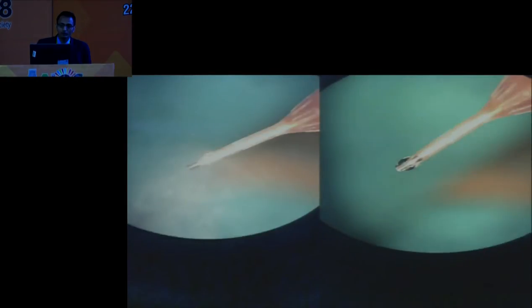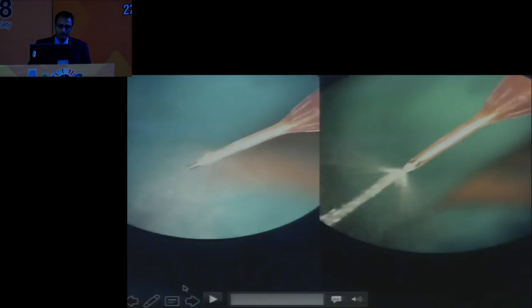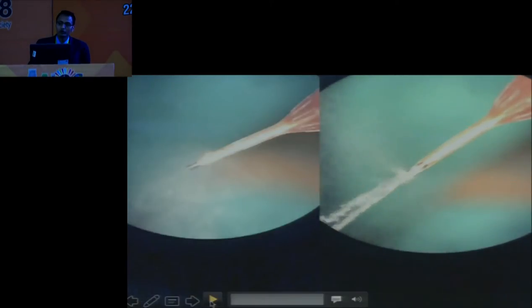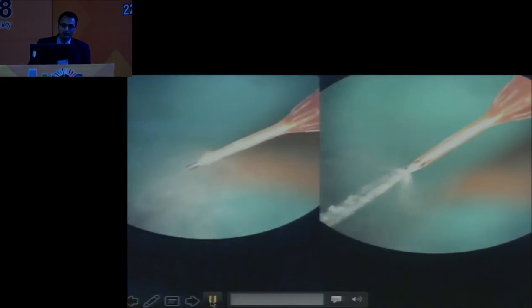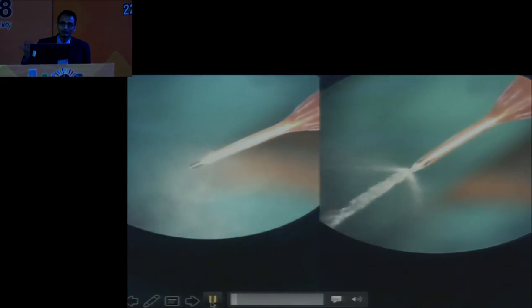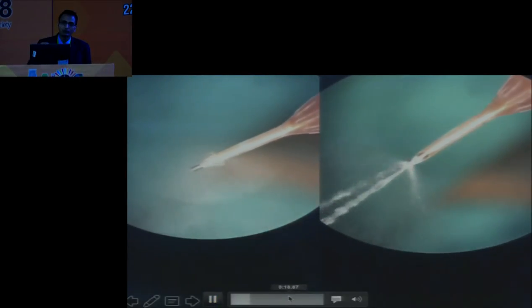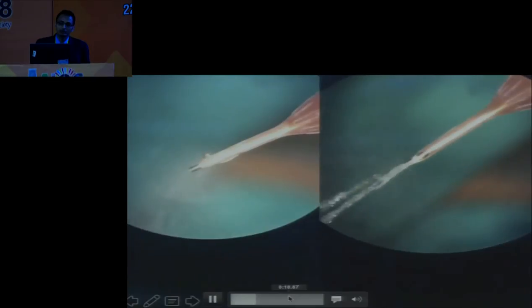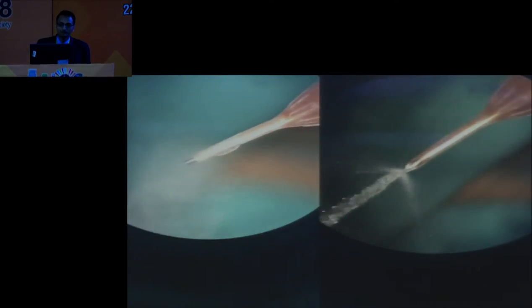Now talking about torsional Phaco, this is a small video that we have tried creating, which shows a torsional plus longitudinal Phaco. That's what is happening. It is similar to a sprinkler in the garden to give water. So it gives the flow even in the longitudinal direction and in the torsional also. And on the left side you can see it is only longitudinal that is happening. So this is what happens actually inside the eye.